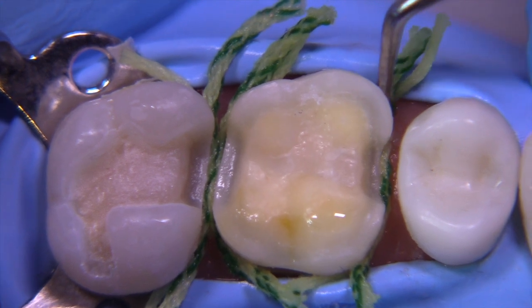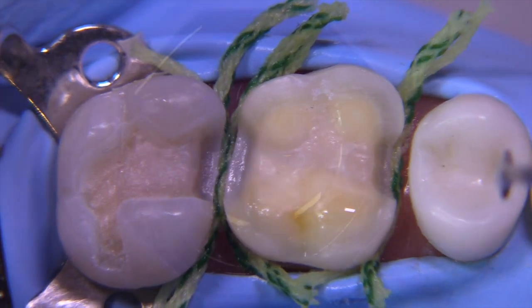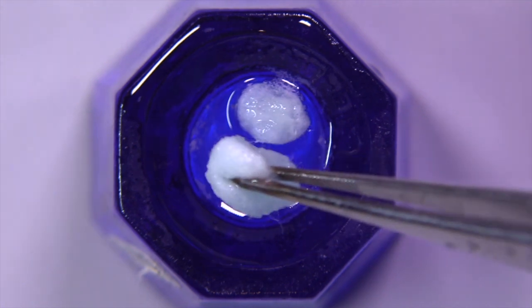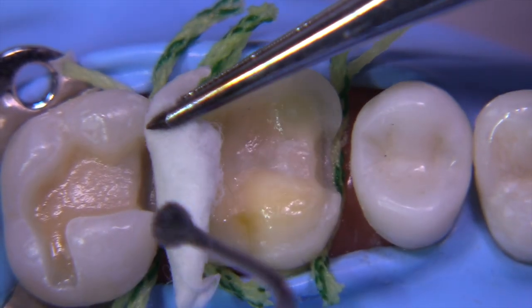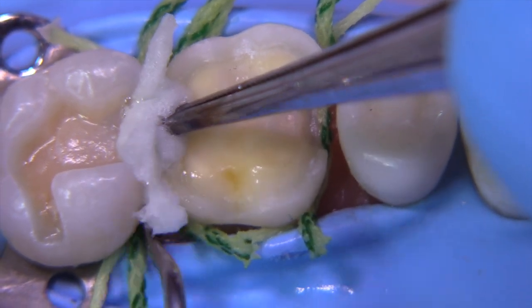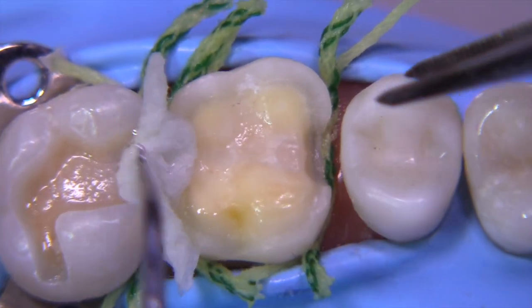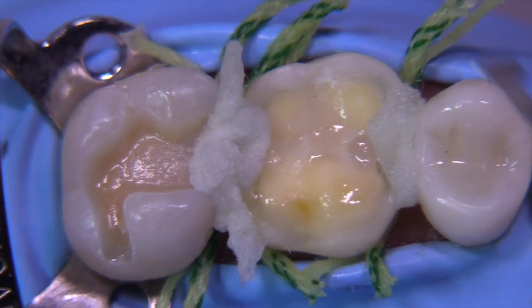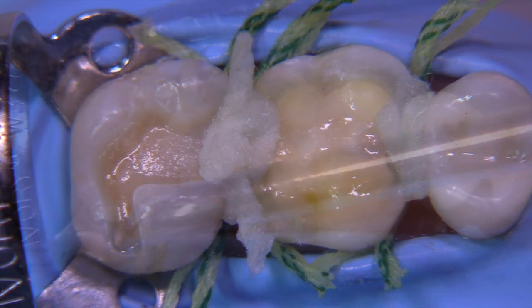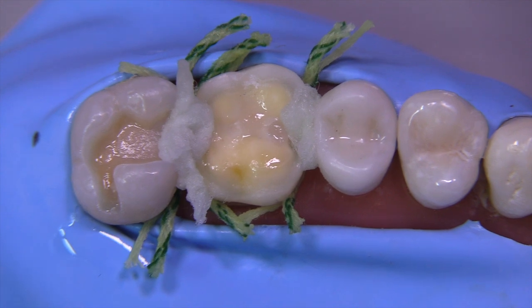Now that you have the six cords placed, we can use another technique called a backup. A backup is simply a little cotton pellet soaked in the aluminum chloride solution — squeeze out the excess and insert it in the interproximal areas. This helps push the tissue down a little further and soak up any tissue fluid. It works really well in cases where you have very angry tissue. It's also analogous to the copper cap pressure technique for full crowns — this version is for inlays and onlays.